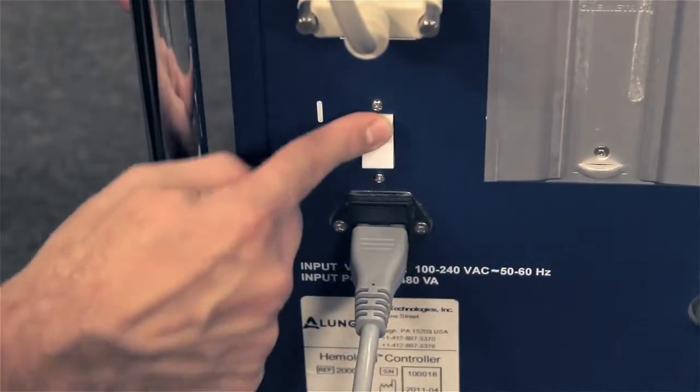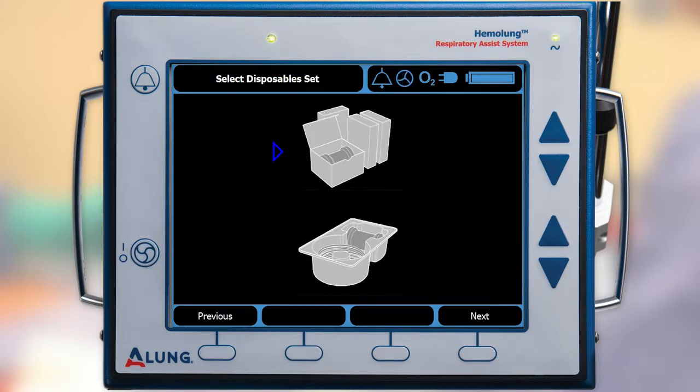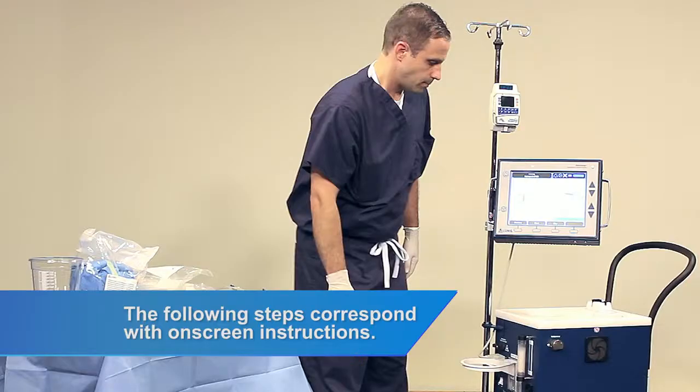Turn on the controller using the power switch located on the side panel. Once the power on self-test completes, press Continue to set up a new circuit. Select the individually packaged disposable set and press Next. The following steps correspond with on-screen instructions.